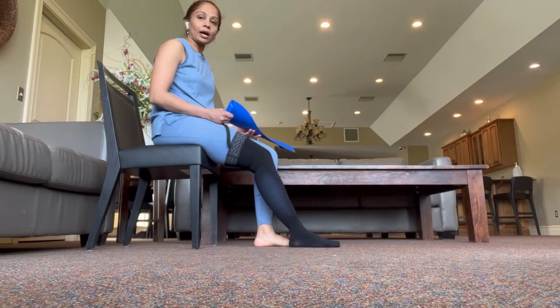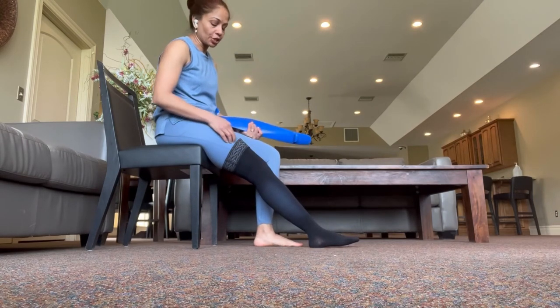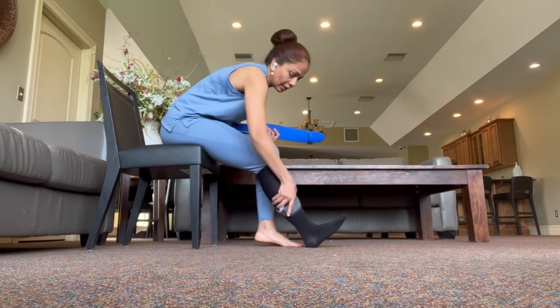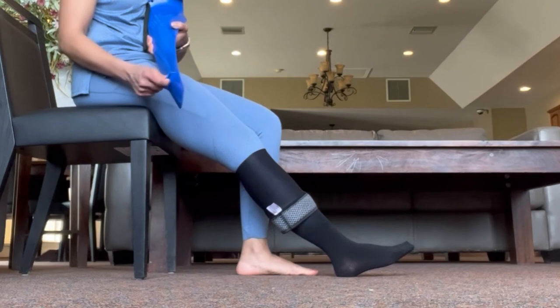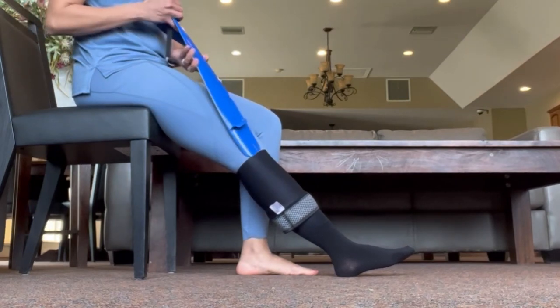Now let's talk about how to take the stocking off. For thigh-high compression, first you want to bring it down below the knee — just wrap it down to end right below the knee. The Sock Ease remover has a little grip on it, and you want to put that on the sock.